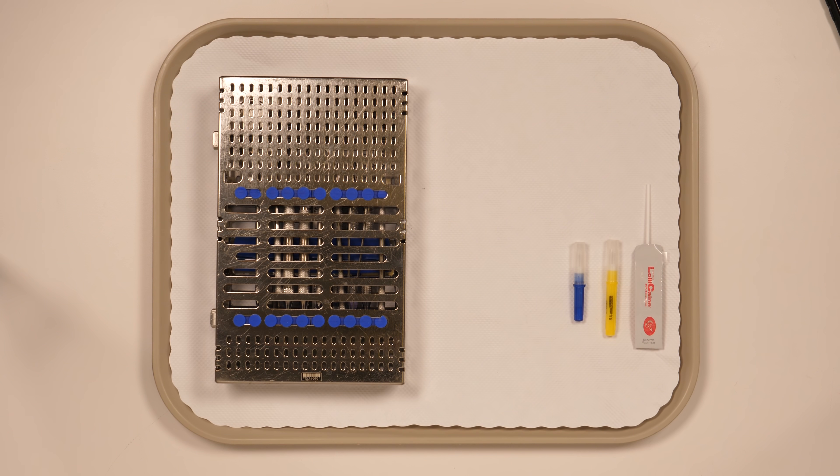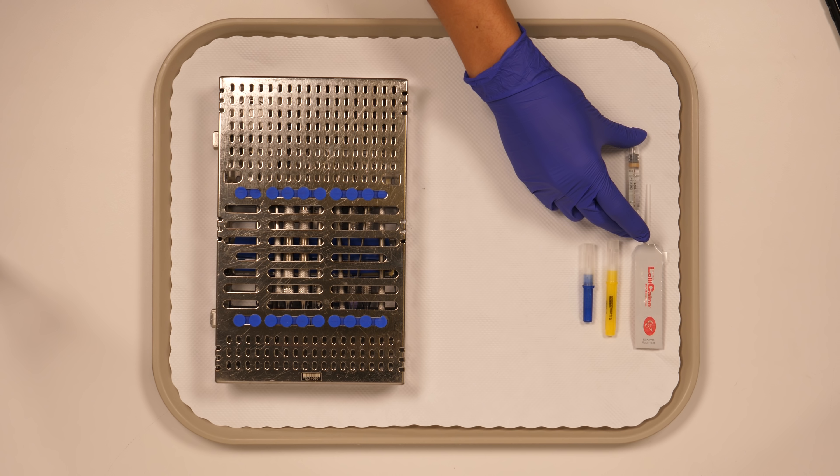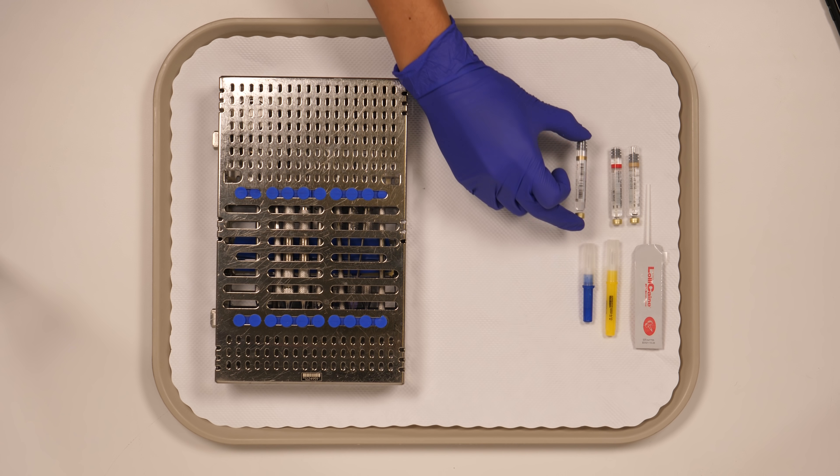Prior to seeing your patient, you'll want to set up your operatory and armamentarium, or instruments.